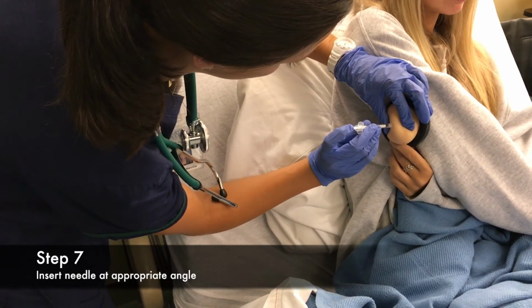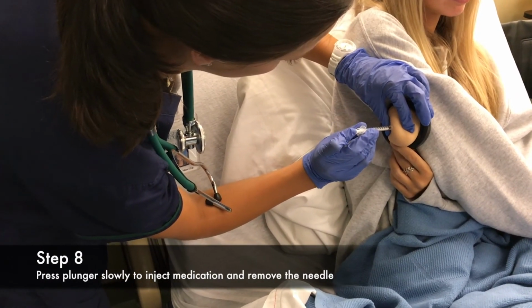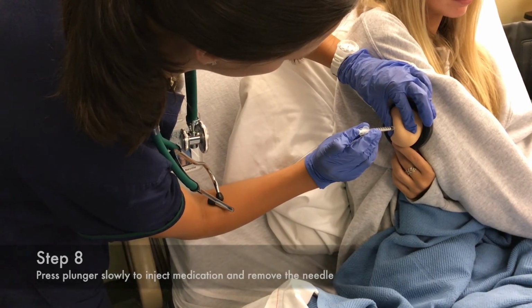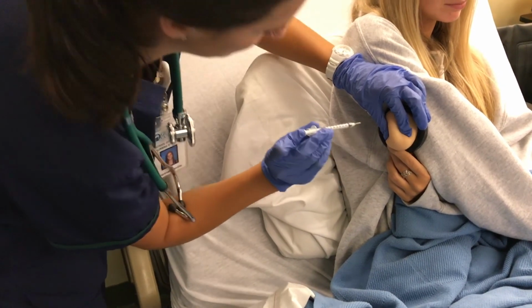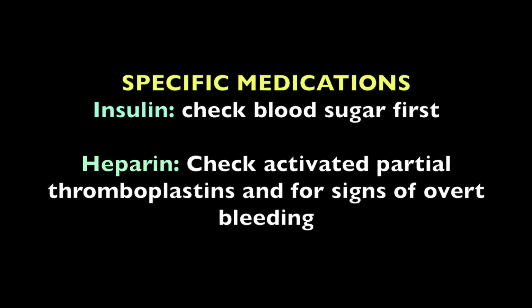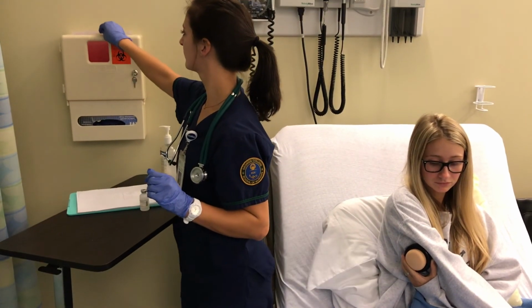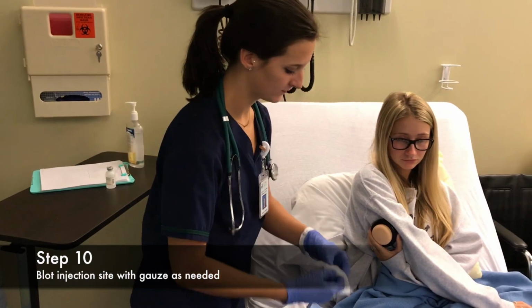Using your thumb or index finger of your dominant hand, press the plunger slowly to inject the medication while stabilizing the syringe with your other hand. Remove the needle. Immediately after injection, dispose of the needle into the sharps box and blot the site with gauze if needed.